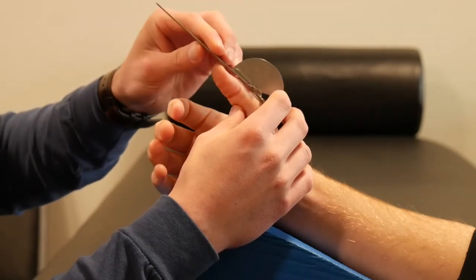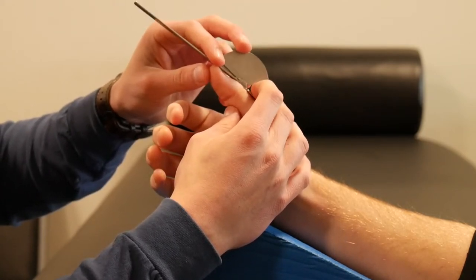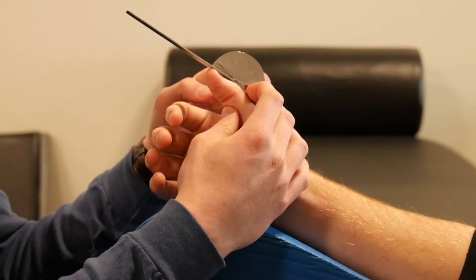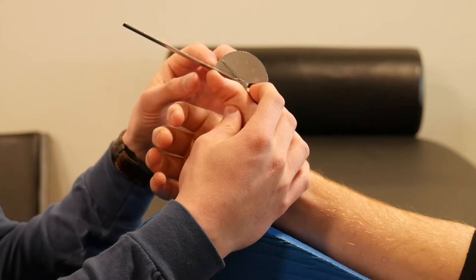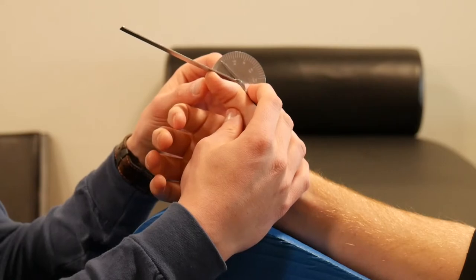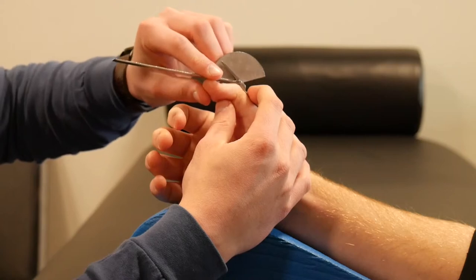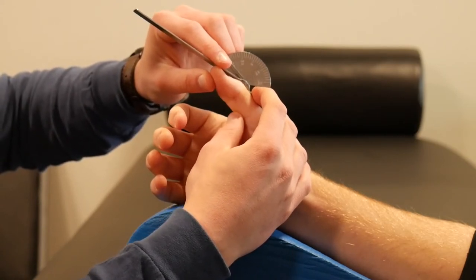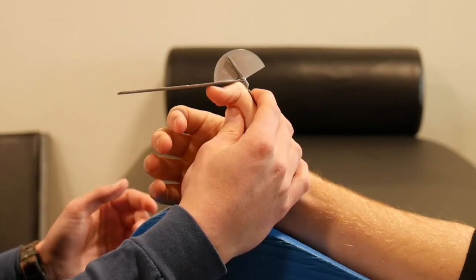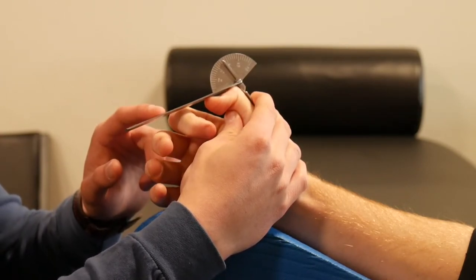For IP joint motion, the same principles apply as with the MP joint. The stationary arm of the goniometer lies along the proximal phalanx of the thumb, the axis lies directly over the IP joint, and the moving arm lies over the dorsal aspect of the distal phalanx. Make sure you don't block the IP joint crease, as that will limit the patient's motion — stabilize proximal to that. Ask the patient to move into IP joint flexion and lightly follow down with the goniometer. I'm measuring at 80 degrees of IP joint flexion.